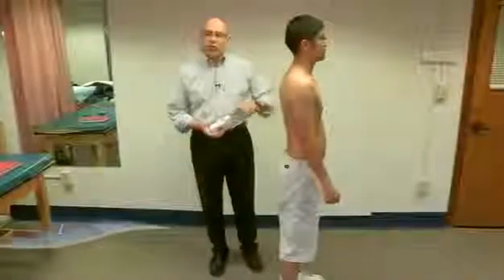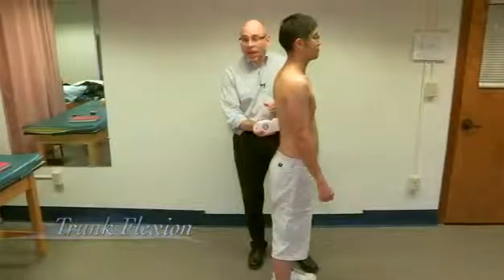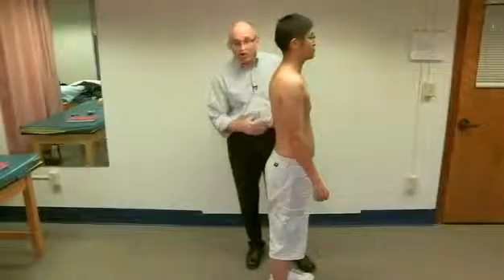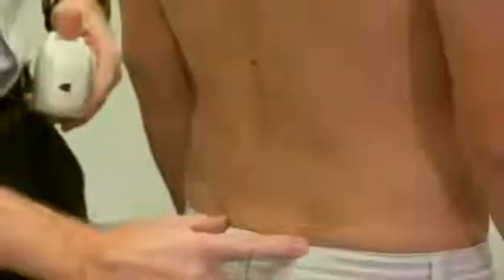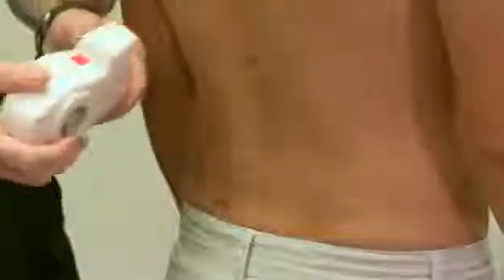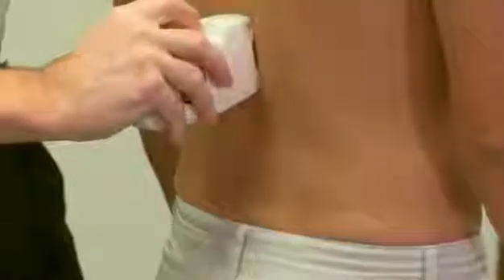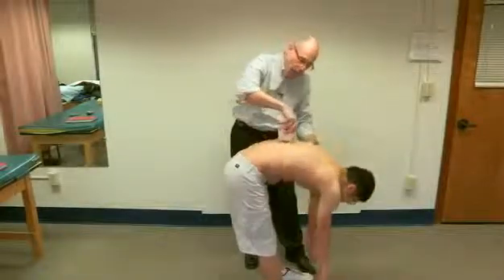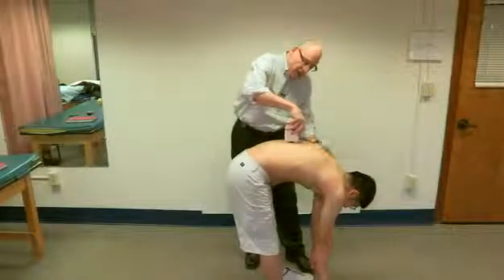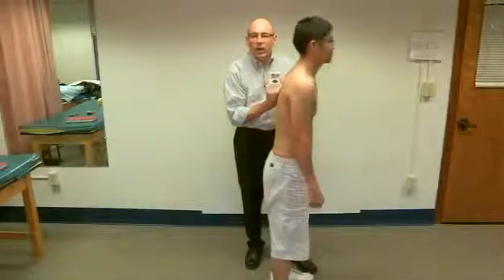We're going to start with trunk flexion. I place the inclinometer at what would be essentially T12. Rather than finding T12 precisely, I've made a line 15 centimeters above the PSIS line. I place the inclinometer there and set it. Reach forward and go down to the floor as far as you can. I click it again and bring it up. He had 104 degrees of flexion.